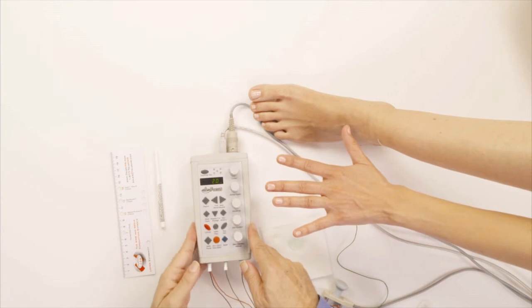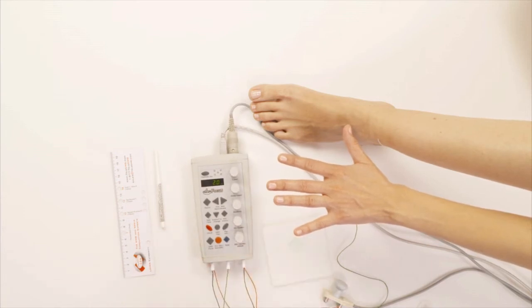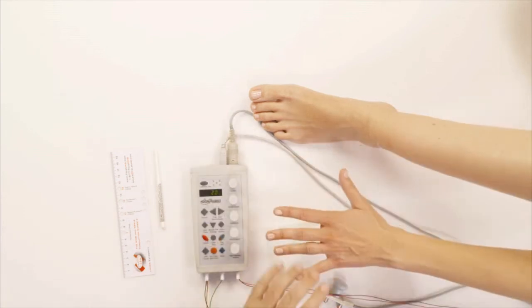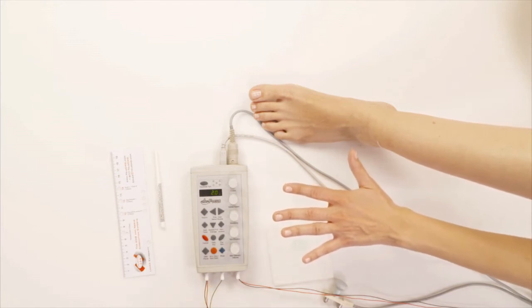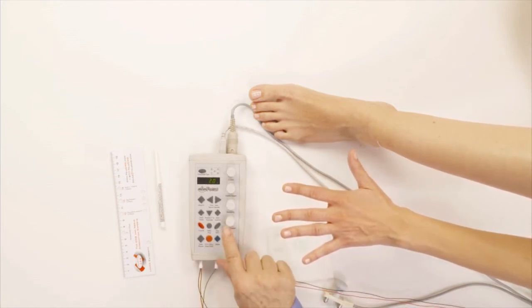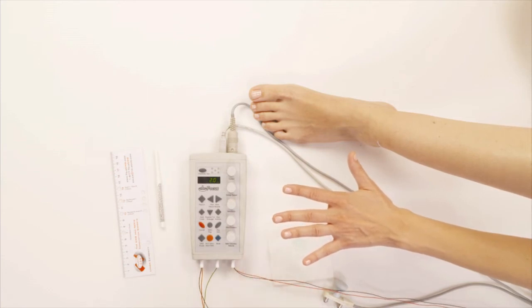And because they are connected, now we have to put the electrodes from each channel in one place. So channel one electrodes will go on the hand and channel two electrodes are going to go on the foot.